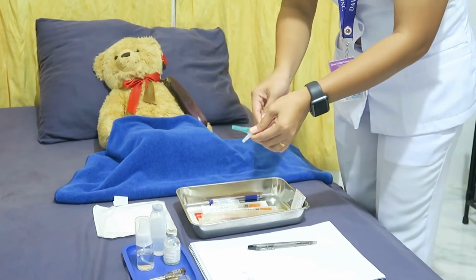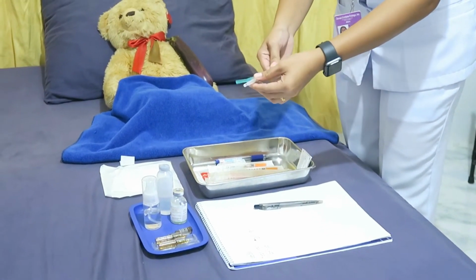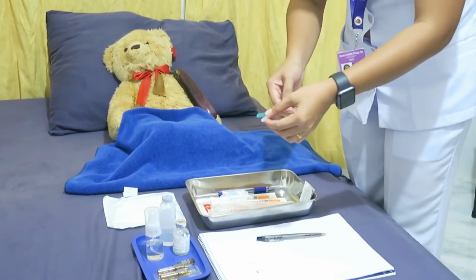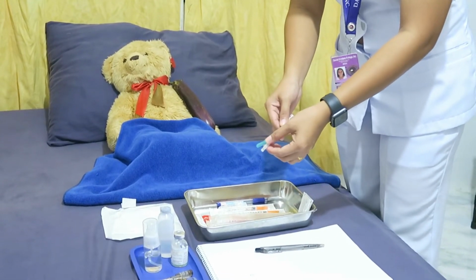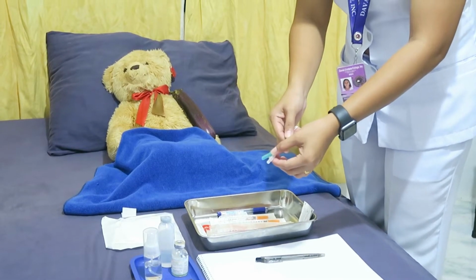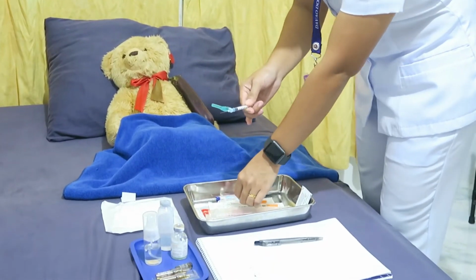Again, ensure that the needle is firmly attached to the syringe. After that, remove the cap from the needle, then draw up into the syringe an amount of air equal to the volume of the medication to be withdrawn. So, I will remove the cap of the needle.